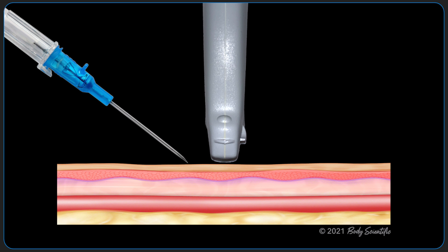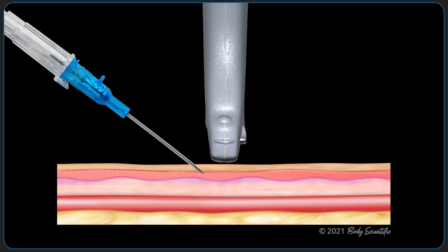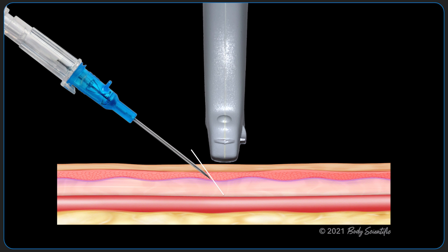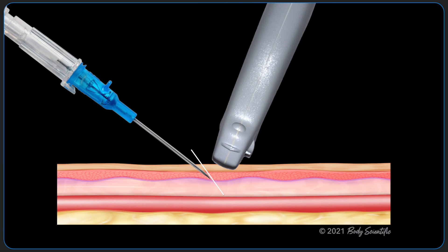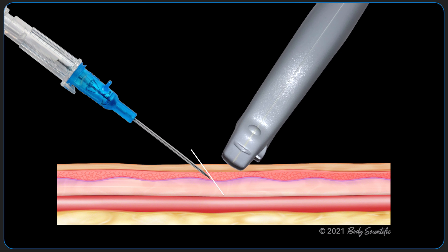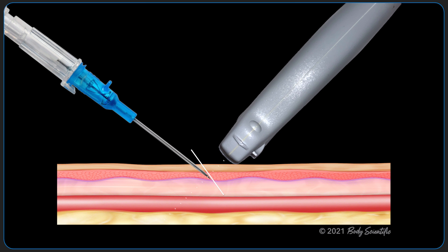The first stage of tracking the bevel is from skin prick to entry into the vessel. The emphasis here is on keeping the beam perpendicular to the plane of the bevel. To do so, the operator tilts the transducer to optimize conditions for visualization.